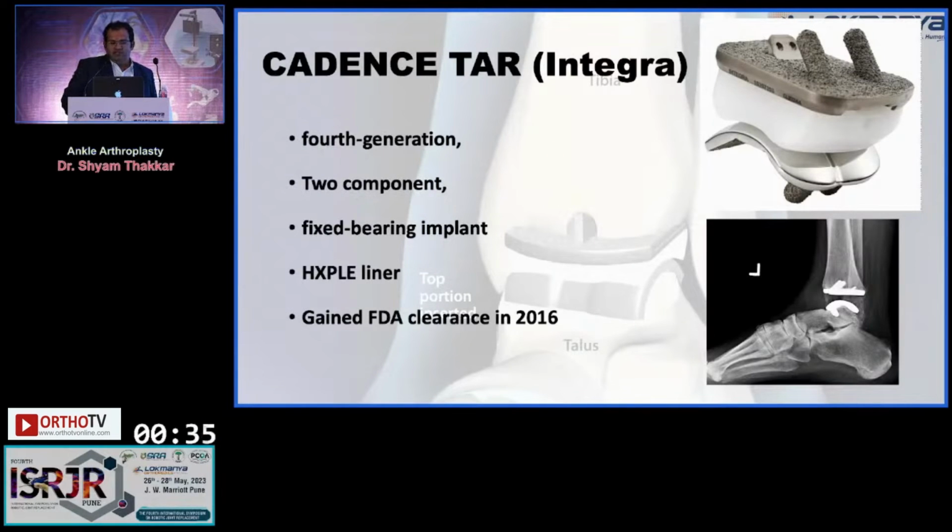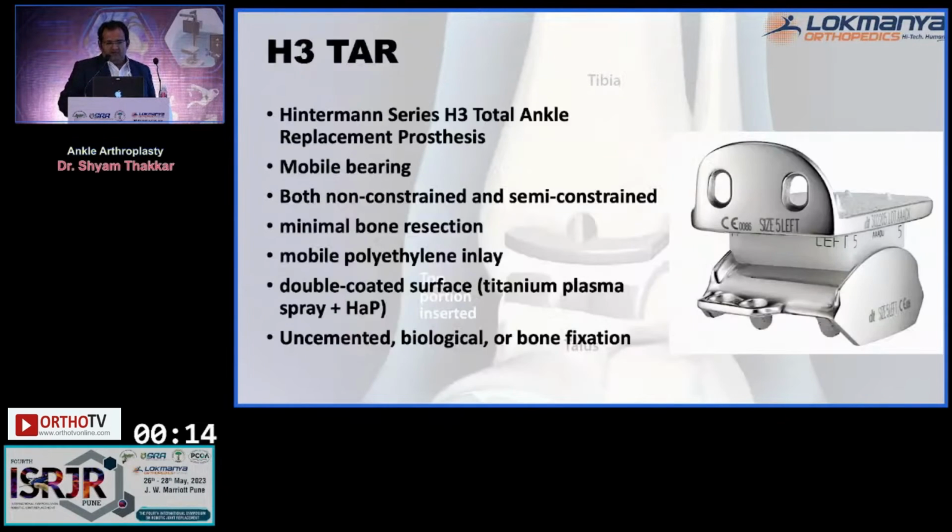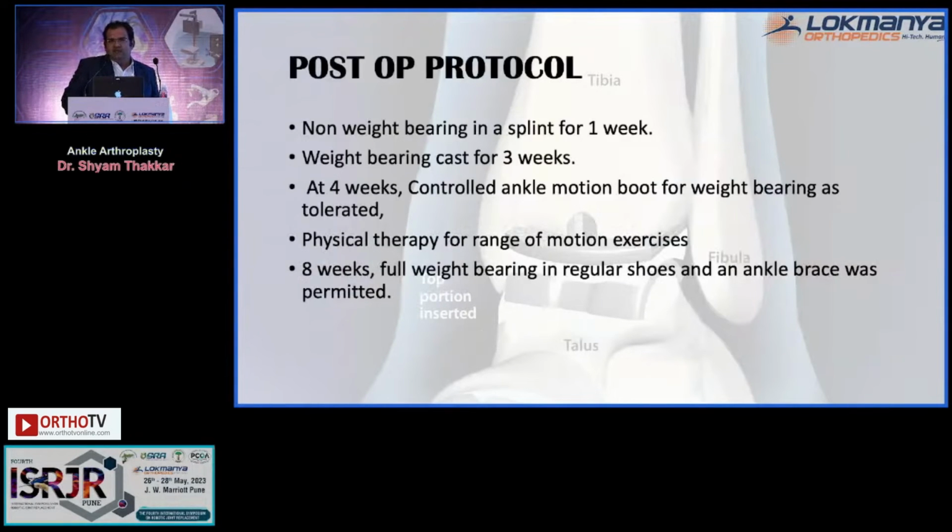Another fourth generation is Cadence, which is of Integra Life Sciences, which is also a 2-component fixed bearing. Nowadays, ankle replacements are shifting from mobile bearing to fixed bearing. Another one is from Exactech, which is Vantage, also comes with 2 and 3 components, but nowadays, as we said, more used is 2 component. Infinity, as we can see, and now this is presently available in India, which is H3 total ankle replacement, which is the Hintermann series, and which also comes with 2 component and 3 component, but mostly again it is used with 2 components.